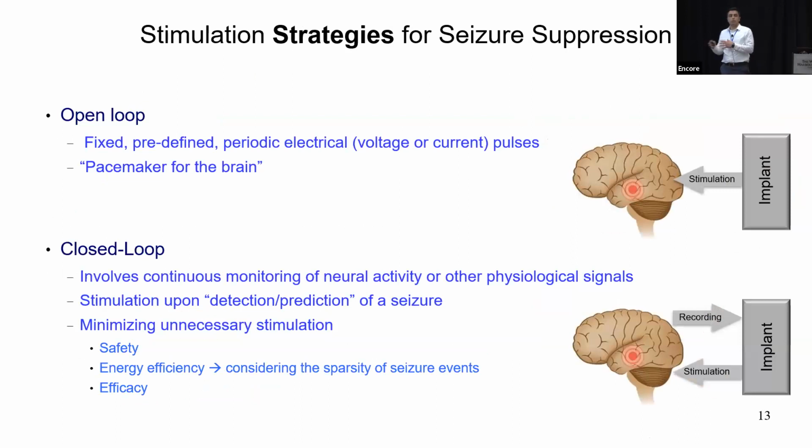So those were the modalities of stimulation. In terms of strategies, we could have open loop and closed loop stimulation. Open loop is pretty much similar to what pacemakers do for the heart.